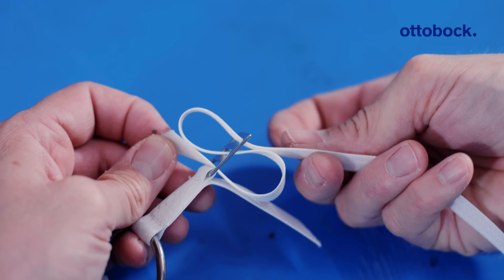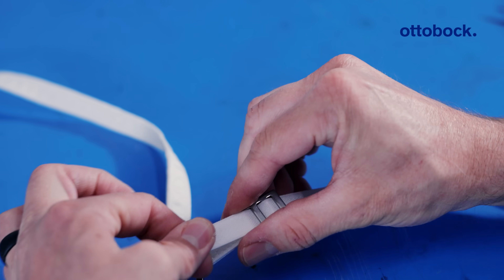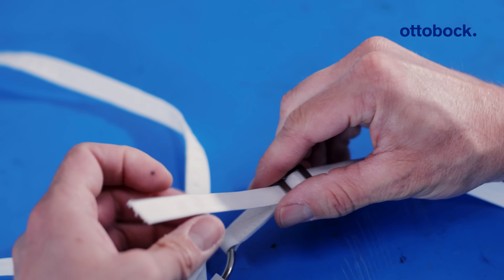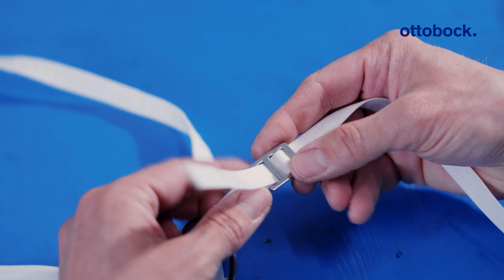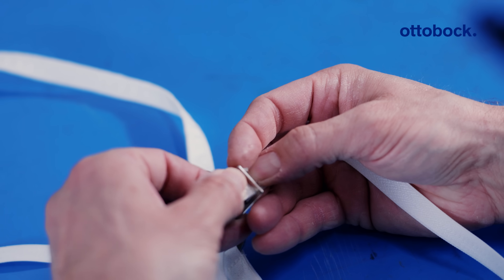It's going to look like this. Pull it tight, and now you can place it on your patient and still have some adjustability to get your tensions just right. Once you have your strap exactly where you like it, you can lock it by placing the end of the webbing back through the end and pull it tight.